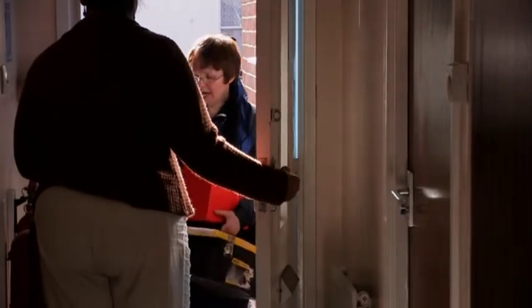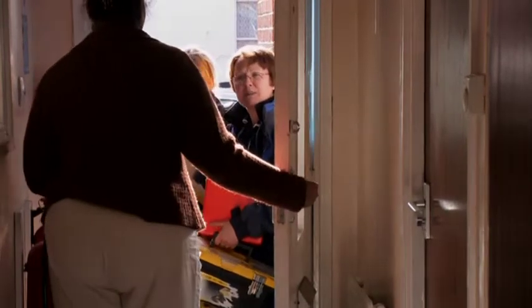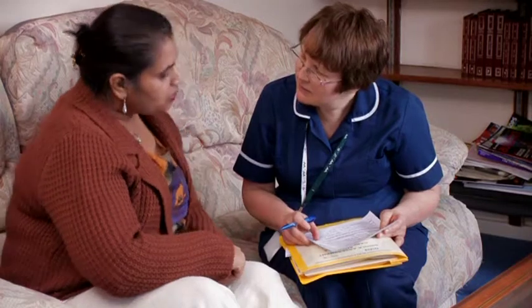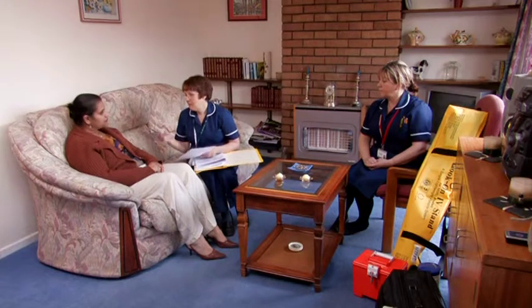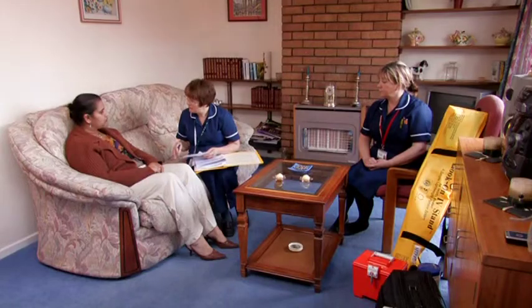It may seem common sense, but always establish the identity from the outset of the person letting you into their home. It will also allow you to establish if it is the correct person that you are there to treat. It is essential to ensure that the patient understands the procedure and gives their valid consent. Check the letter of authorization and the ID of the patient, the prescribed fluids, drugs and expiry dates to maintain safety and ensure the correct treatment is administered.